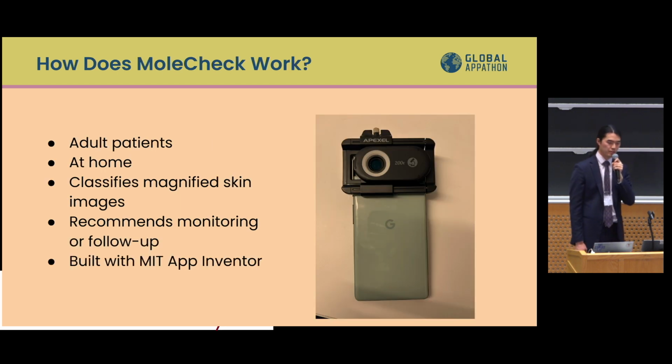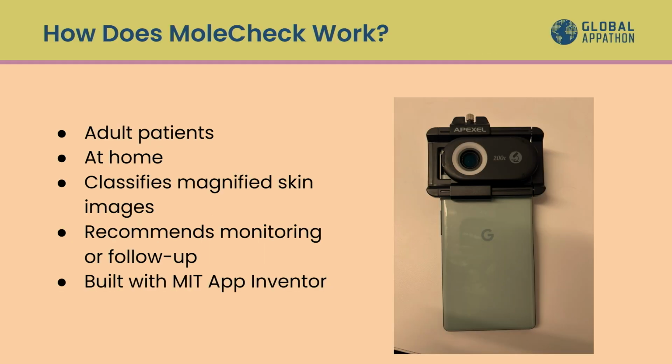So how does MoleCheck work? MoleCheck helps adult patients outside of healthcare settings classify magnified photos of their pigmented skin lesions as concerning or benign and decide whether to monitor or immediately follow up with a doctor. MoleCheck was built with MIT App Inventor and does require both an Android phone and a phone microscope lens shown on the right.